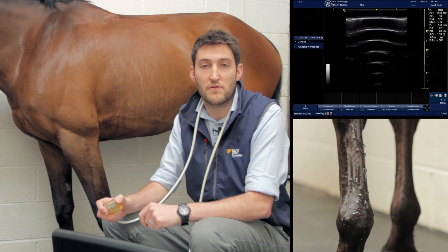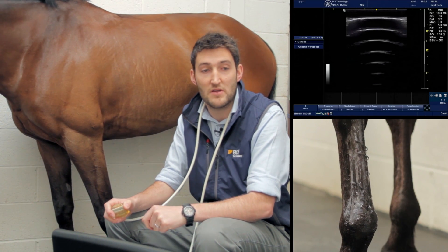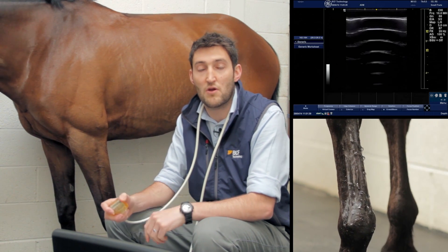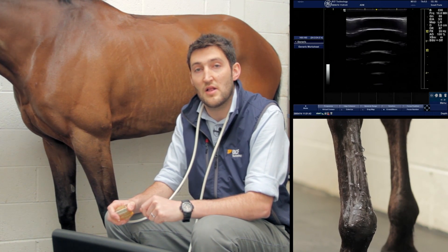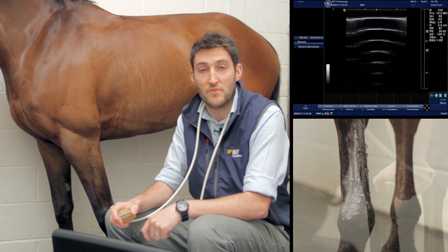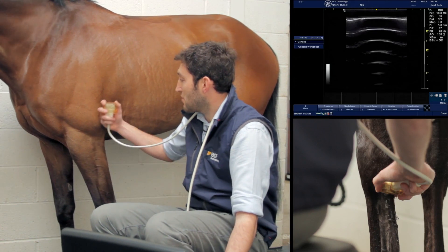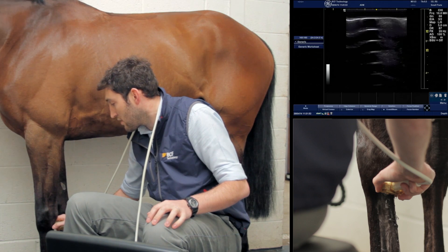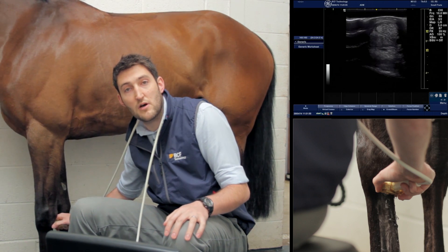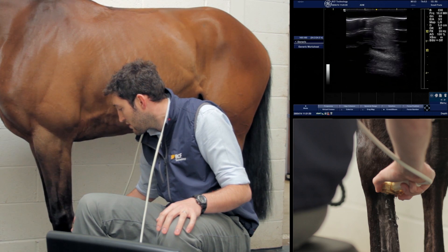In this part of the video we're going to look at the region of the proximal metacarpus, dividing it into zones. We'll be checking zone 1a first, then moving on to zone 1b and so on. The machine is set up nicely with the patient calm, and we'll start just below the accessory carpal bone.